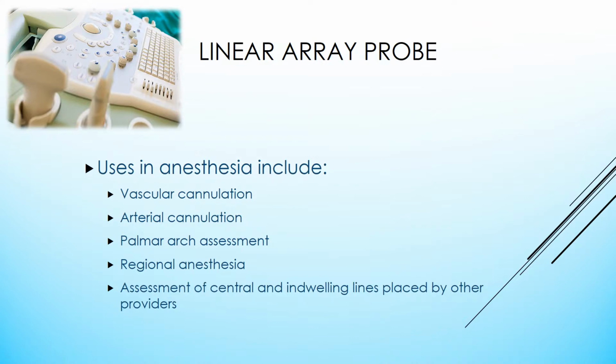Uses in anesthesia include vascular cannulation, arterial cannulation, Palmar arch assessment, regional anesthesia, and assessment of central line and indwelling catheters placed by other providers.